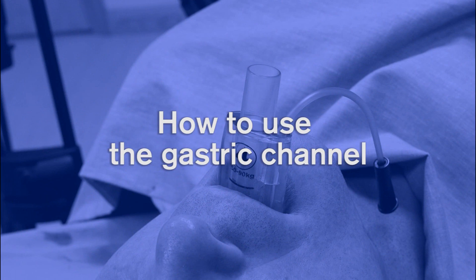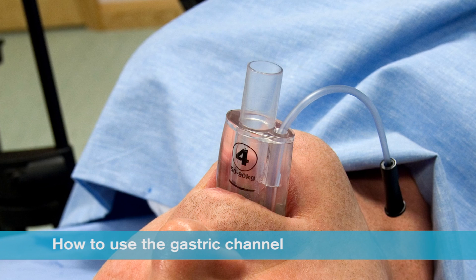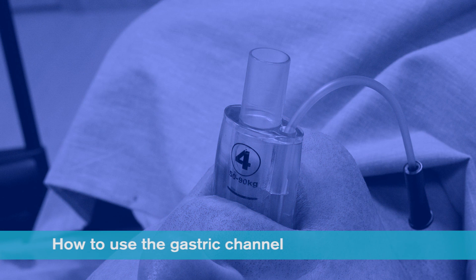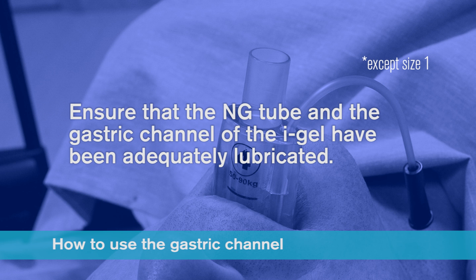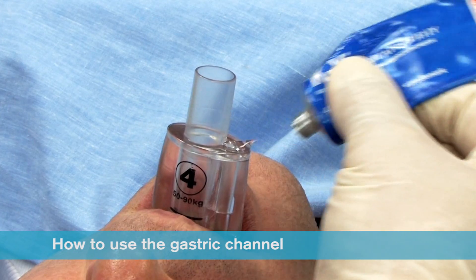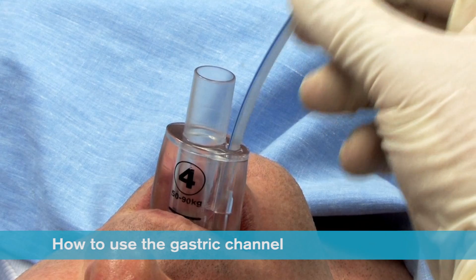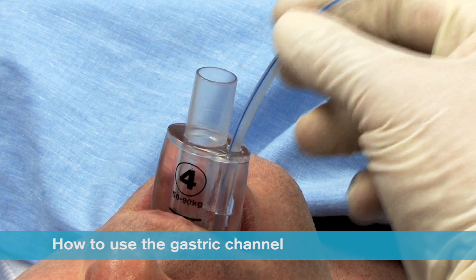How to use the gastric channel. If required, a nasogastric tube can be inserted down the gastric channel of the iGel. For a quick and efficient insertion, it is important that the nasogastric tube and the gastric channel of the iGel have been adequately lubricated before insertion is attempted. The ideal way to achieve this is to place a small bolus of lubricant over the proximal end of the gastric channel. The nasogastric tube should then be inserted a short way down the channel and moved in and out to prime it before completing insertion.